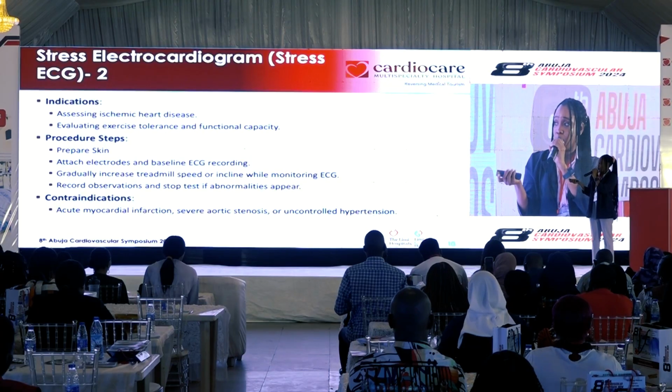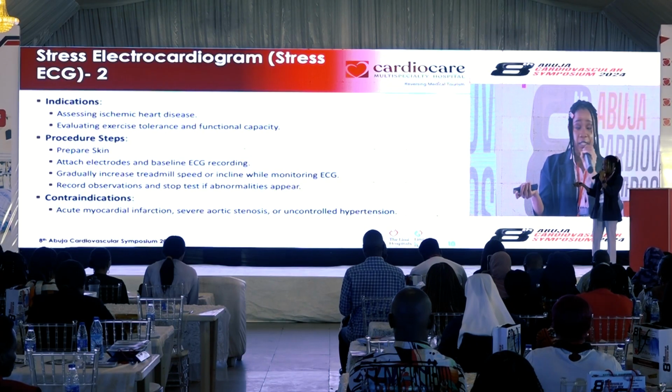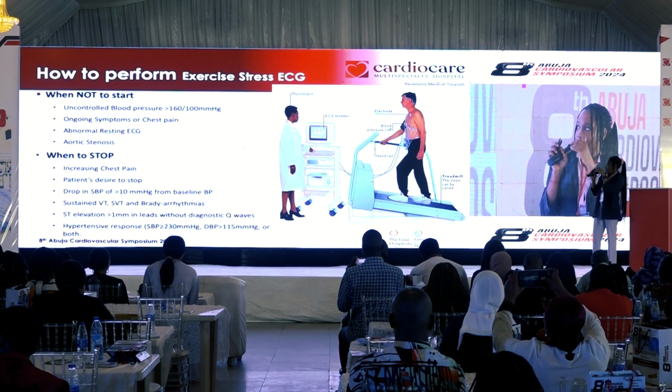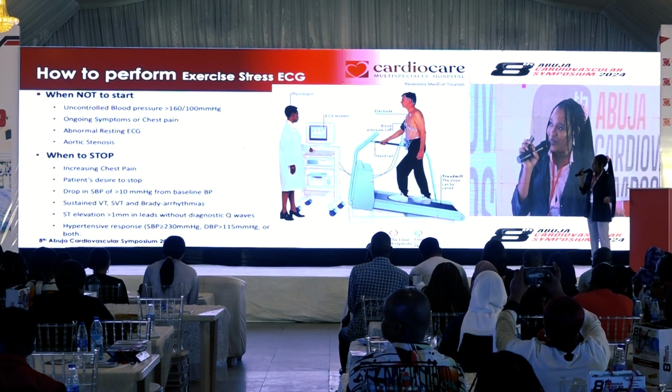So please, it's good to go through their record and why they're there for the test. If you see any of these contraindications, we don't start the test. Okay, so that's the physiologist trying to run the test.